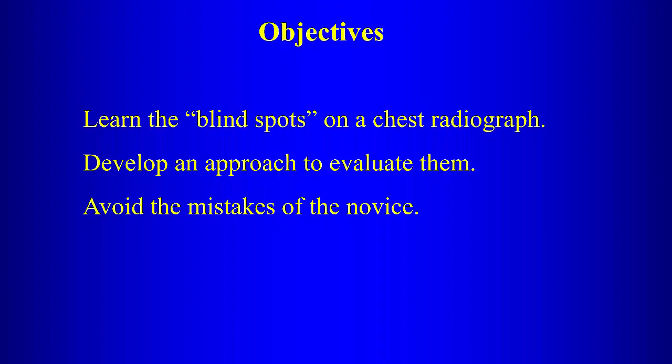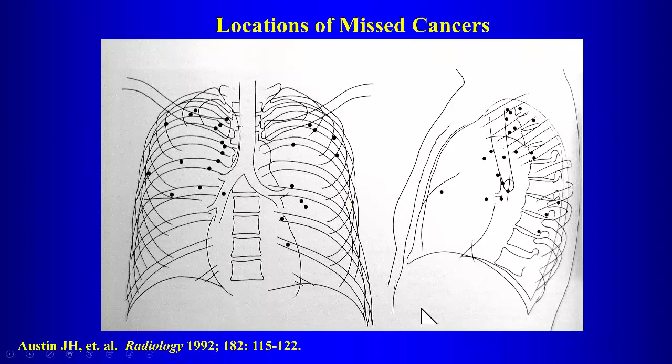In many respects, of all the lectures you're going to get this year, this is probably the most important one. And you're not going to have a test on this, because your test on this, if you're reading chest radiographs, is going to be every day in practice. And the penalty for failing that might be a malpractice suit. So I would urge you to pay attention and to apply some kind of systematic methodology when you're reviewing chest radiographs.